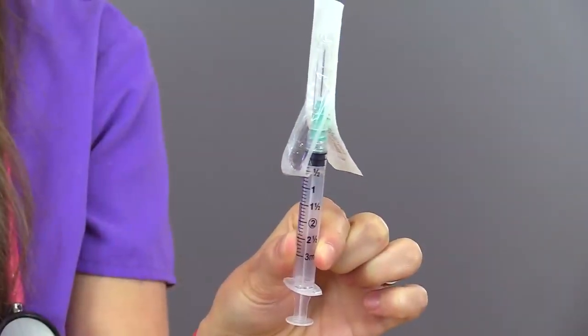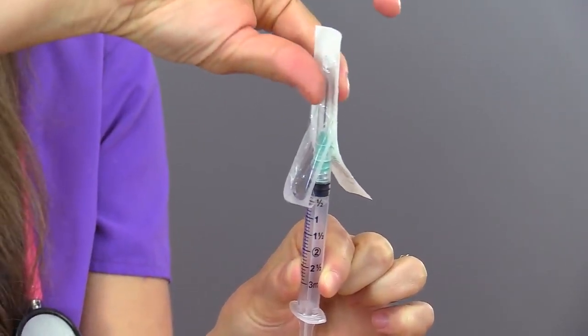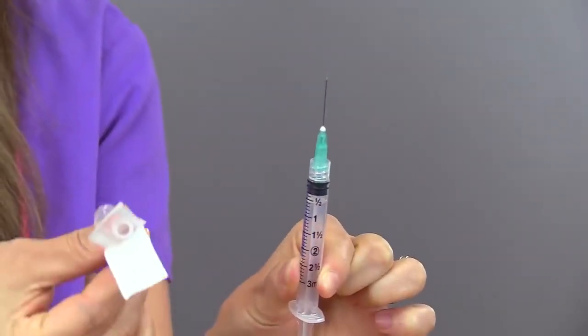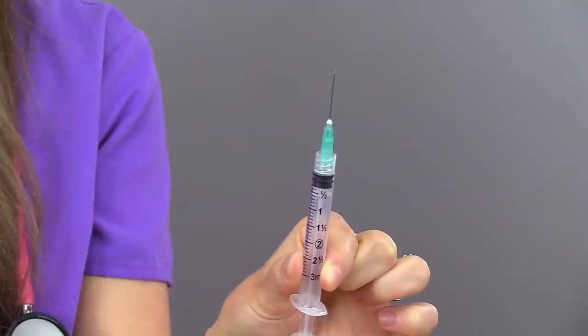Therefore, to do this, we're going to hold our syringe at its barrel, and then we're going to remove the cap and its packaging in one smooth motion. And we're going to keep the cap inside the packaging and just put this in a secure location for when we need it later.